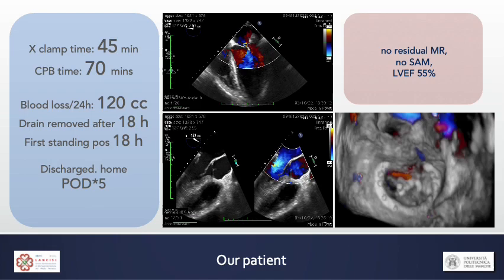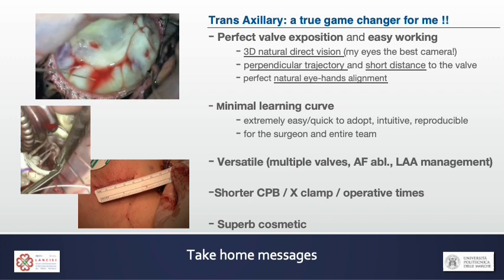With this approach you saw how easily you get to the mitral valve and the great exposition you get with all the advantages of a natural 3D view. This approach also ensures a minimal learning curve and can be used for aortic and tricuspid valve interventions, AF ablation, and left appendage management, with short operative times and superb cosmetic results, increasing patient satisfaction. This is why the transaxillary direct view approach is a true game changer.